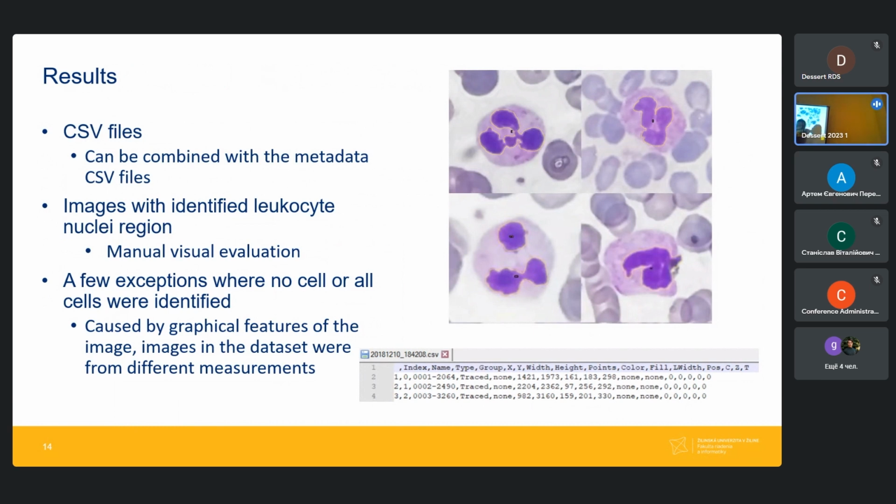But the dilate function takes the border and moves it, say, 1 pixel further, like that. This gives the opportunity to connect the pixels that are close to each other and have the white part.